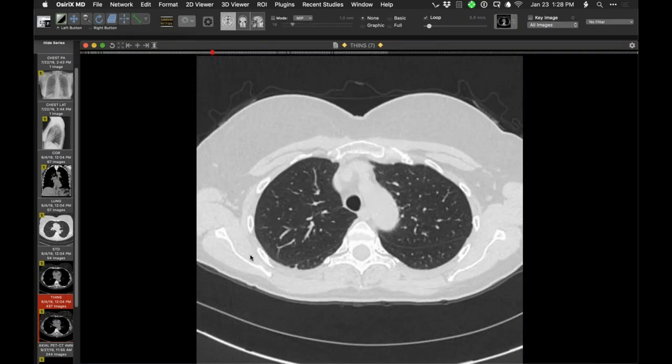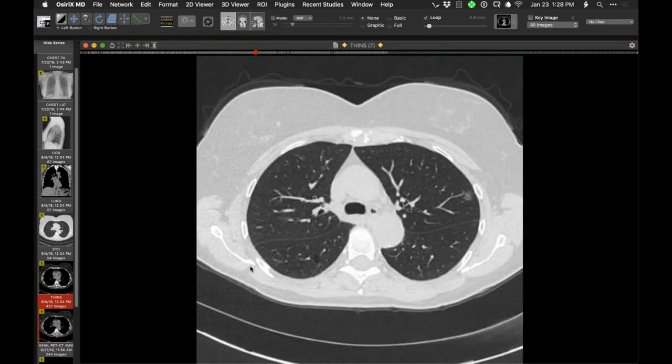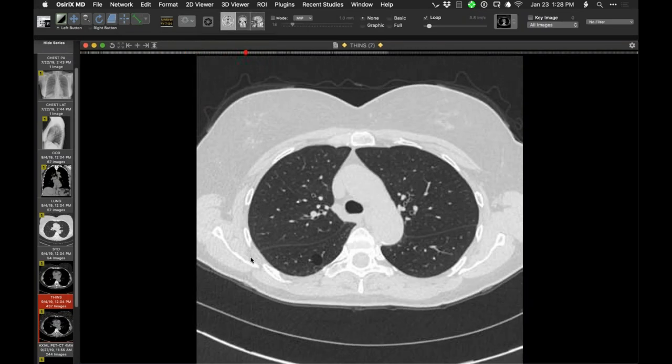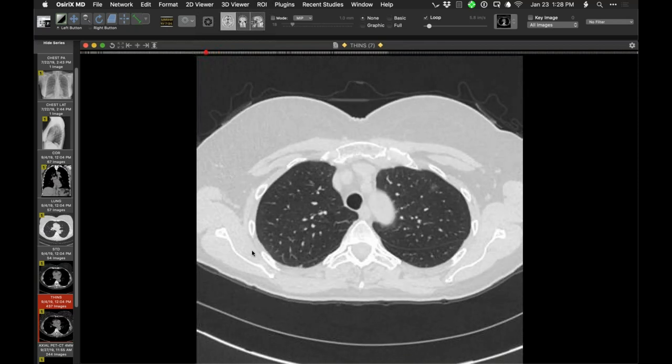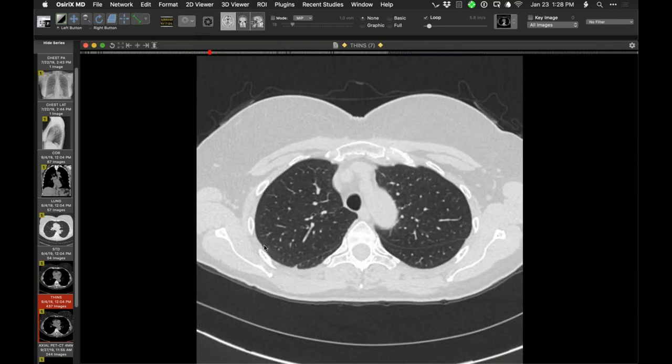A nice demonstration of three synchronous lesions — and you certainly see that, but they're all in one lobe. Those are mine, Howard. All right, thank you, Howard.